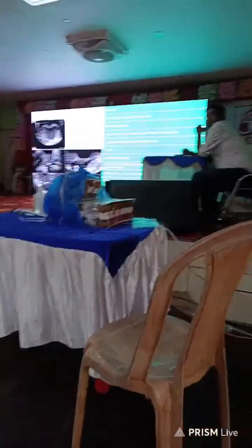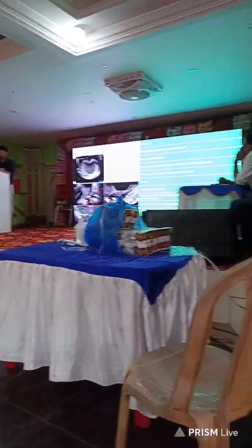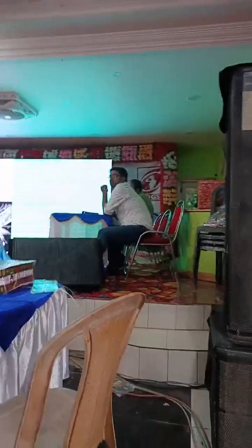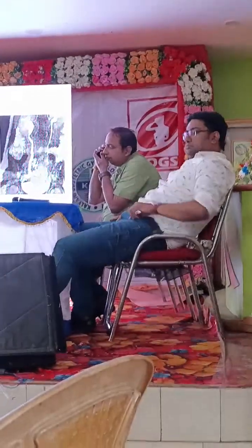Posterior surface of the uterus, irregular uterine end of the uterosacral ligament, distal hydroureter, irregular bladder wall, adenomyosis and fibroid. So MRI is the second line management, better for visualization of deep infiltrating endometriosis. When not diagnosed by TVS or clinical examination, MRI can be done.